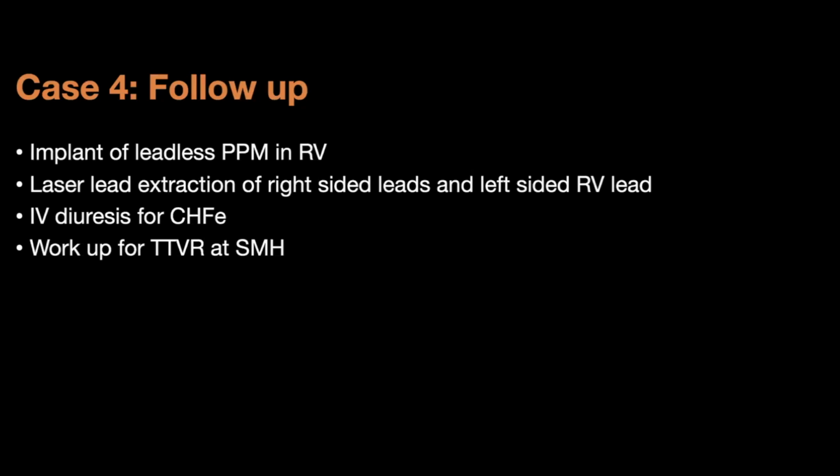So those are the new situation. It used to be we just ignore the right side, and we focus on the left side, on the mitral valve, in terms of mechanism, why it was leaking. Now it's the right side that we have to do that as well. So I think it requires thinking when you're actually scanning. That's a good point.